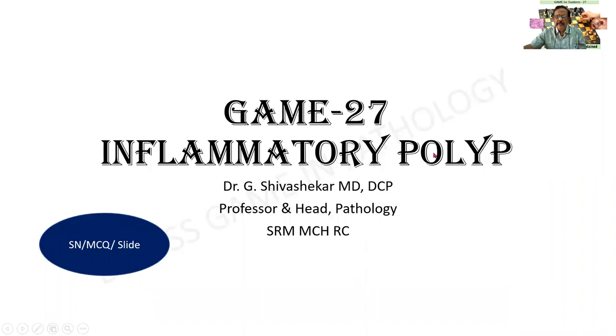The term is inflammatory polyp. Inflammatory polyp is common in the nose and the sinuses. A polyp is a lesion that projects above the surface. And this can be asked as an MCQ, but the slide is very common in all the universities.